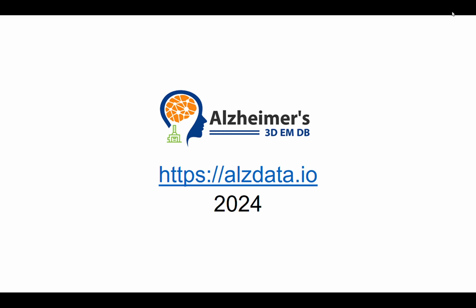Welcome to our virtual tour of alzdata.io, a new resource that's displaying highly unique human image data of Alzheimer's disease at never-before-seen microscopic levels. This website presents a rare case of highly preserved human biopsy data from a patient suffering from severe Alzheimer's-related dementia.